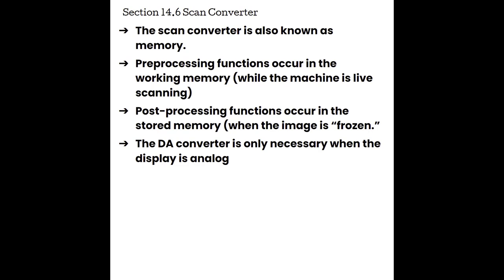They are more digital monitors, so they can accept the information straight from a digital scan converter, where some older systems did have analog monitors and they could not accept that information from the digital scan converter, so we had to change things back. So we'll cover all of these a little bit more in detail over the next few minutes here. These are four important things to keep in mind while we cover those details.